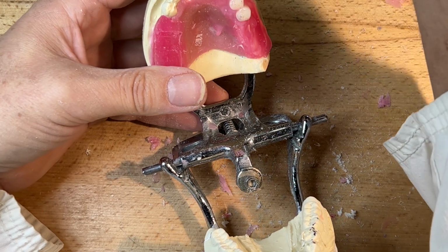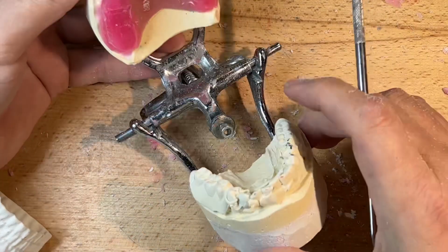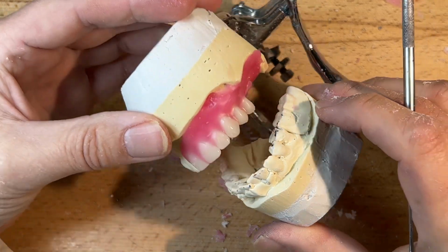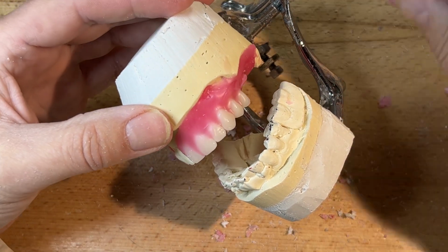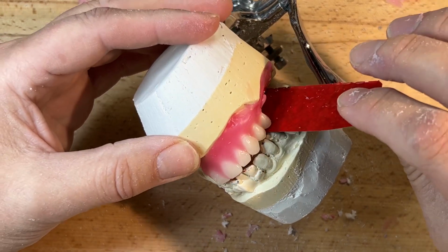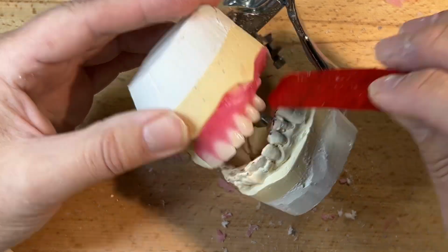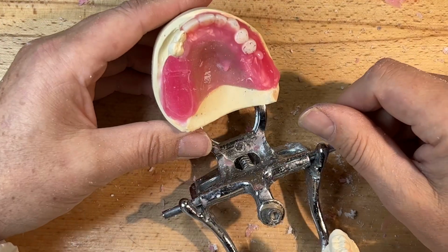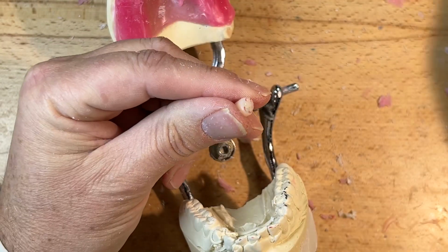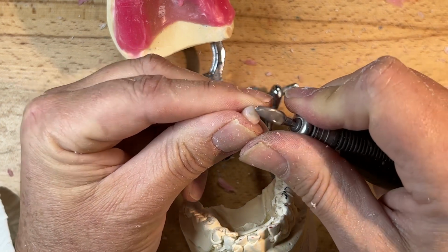These days, the denture teeth are pretty much full anatomical width. I think the earlier days would have, Dr. Gysi's philosophy of having a smaller occlusal table, therefore having less tipping motion, probably 75% of an occlusal table of a natural tooth. And now we're probably closer to 95. I don't see too many of those. Those are kind of gone by the wayside. It's kind of narrow buccal lingual.